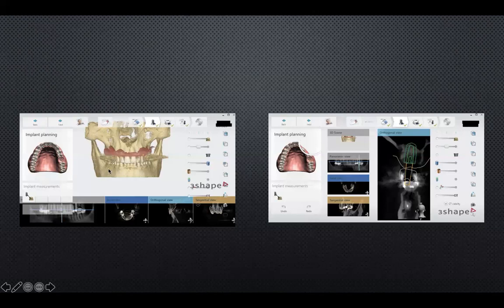From here, the system moves you to the next step, which is designing your prosthesis, which is a single crown or fixed partial denture. So you design your crown how you like it, with the proper occlusion and mesial-distal position and facial-lingual position as well. Once you are satisfied with this, you will be able to design your implant.